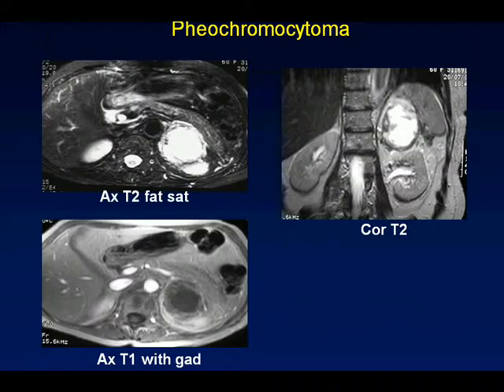Another case of a pheo, this was possibly thought as maybe a cystic met. It's very cystic looking, or a necrotic met, or even a necrotic primary adenoma, because she actually clinically didn't have symptoms of pheo. This was actually a non-functioning pheo, and that's, as I mentioned, history is quite important.